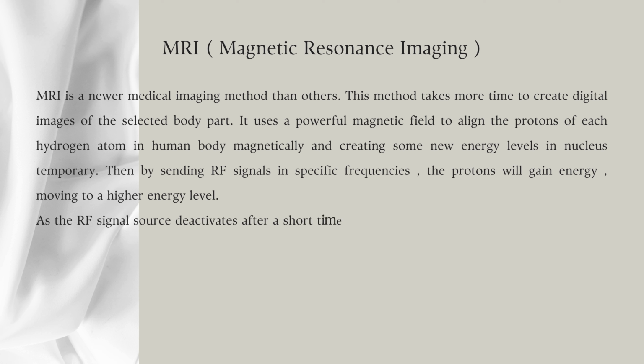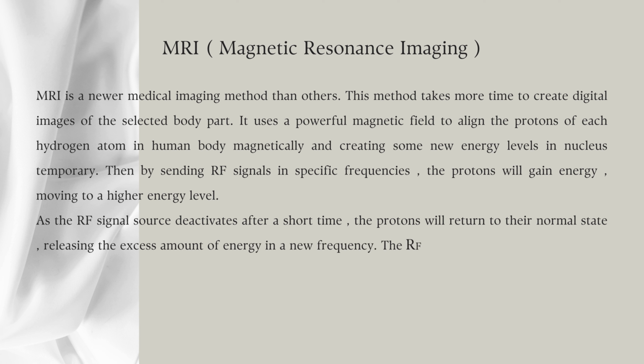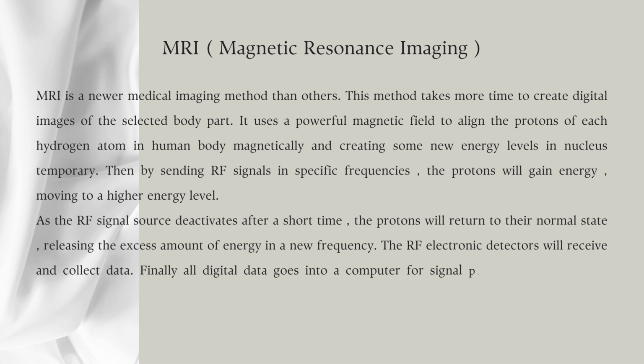As the RF signal source deactivates after a short time, the protons will return to their normal state, releasing the excess amount of energy in a new frequency. The RF electronic detectors will receive and collect data. Finally, all digital data goes into a computer for signal processing and creating medical images.